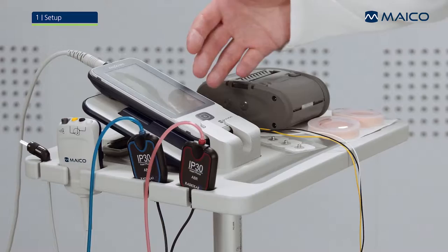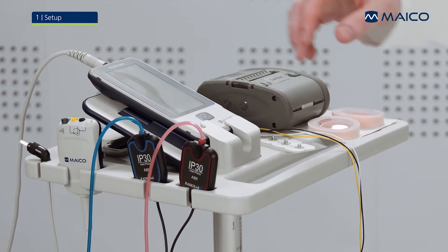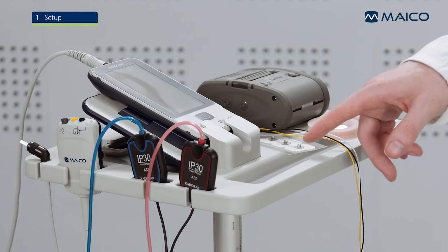You will need the EZ-Screen, the pre-amplifier, the insert phones, electrode lead wires, disposable electrodes, and the ear cups.